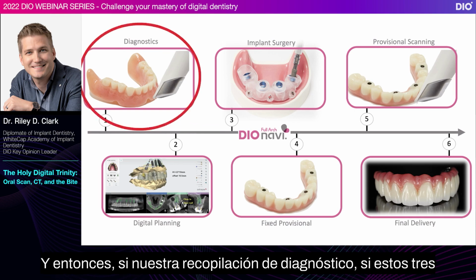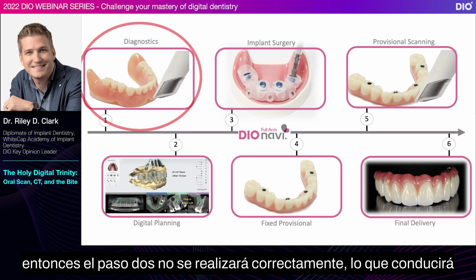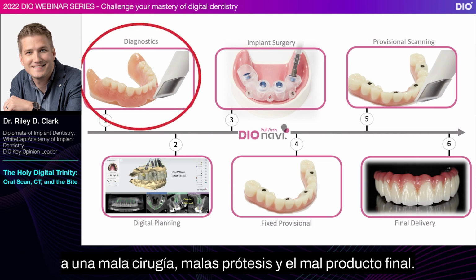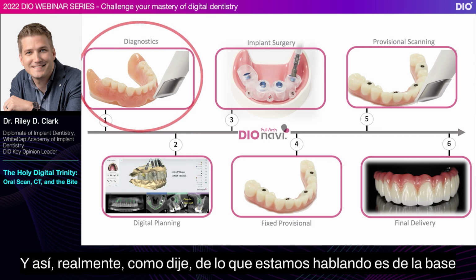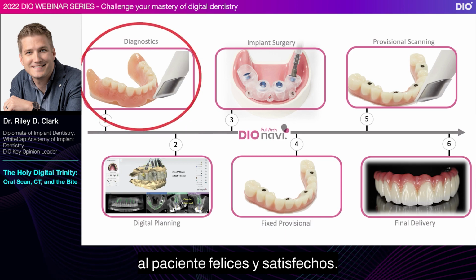If these 3 data sets are not obtained in an accurate, proper way, then step 2 will not be done properly, which will lead to bad surgery, bad prosthetics, and a bad final product. Really, what we're talking about is the foundation of thoughtful, predictable workflows that leave you and the patient happy and satisfied.